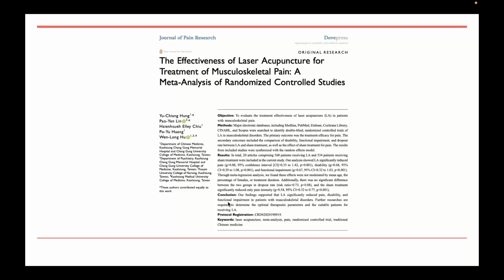Okay. All these reviews and meta-analyses point out the need to report, to control, and to standardize those treatment parameters. If you feel a bit overwhelmed with the joules, watts, and so on, there is good and bad news. Bad news is that you do need to understand those if you really want to understand what you're doing and get the most from laser therapy. And good news is that it's not that hard, and that once you are a bit fluent with that, it becomes as easy as calculating dosages for drugs.